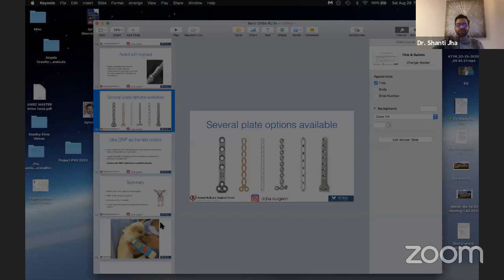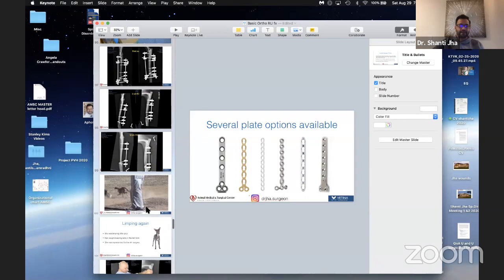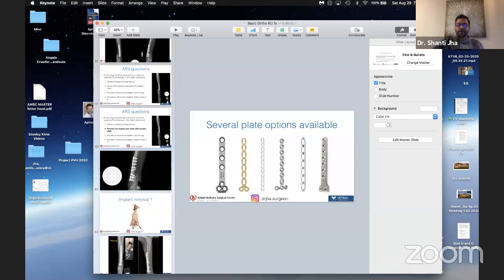Okay. Dr. Sridhar has asked, two screws in the distal fragment. Is it the minimum requirement? Okay. So Dr. Sridhar, good question. Answer is yes. And I would say if you're using a locking plate system and you can put two screws, that would be fantastic. You don't have to use anything more than that.